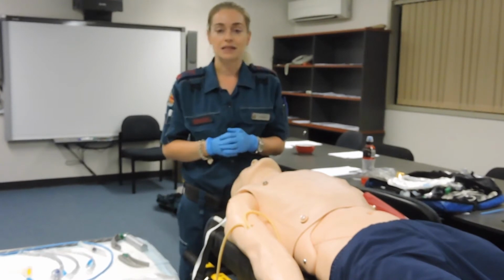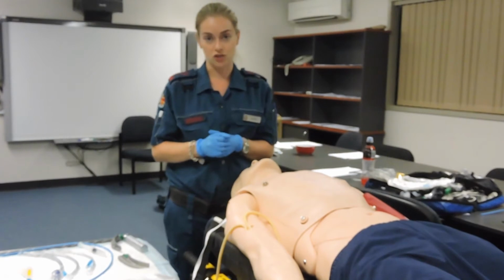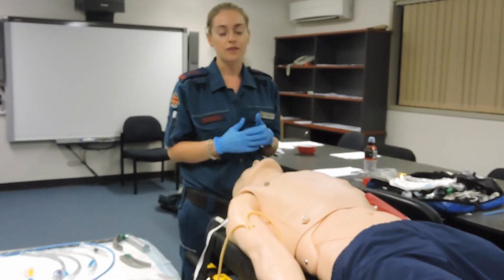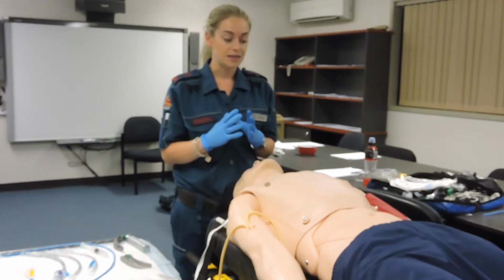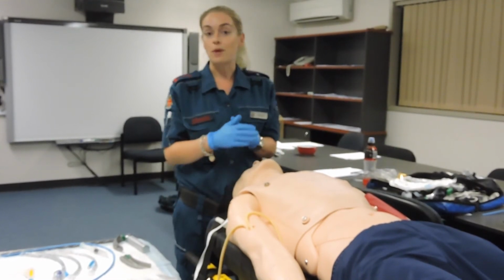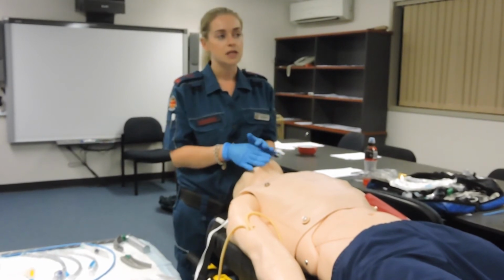If that doesn't succeed, we're still having a can't ventilate situation, and we move on to the next step. In both cases, we go for our next backup airway, which is an LMA. If our LMA is able to ventilate and oxygenate the patient and has a good seal, then we manage as per the rest of the case, and we just continue with an LMA.